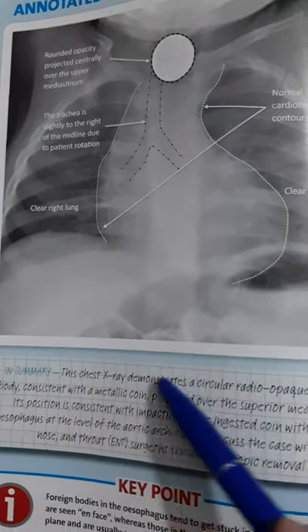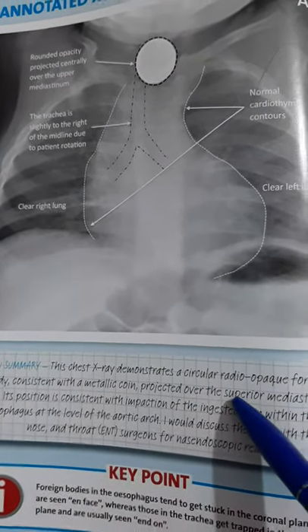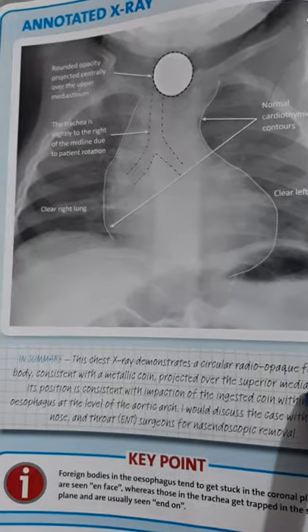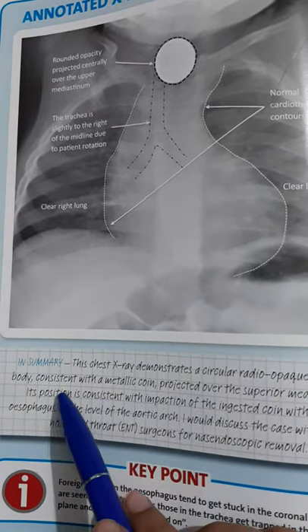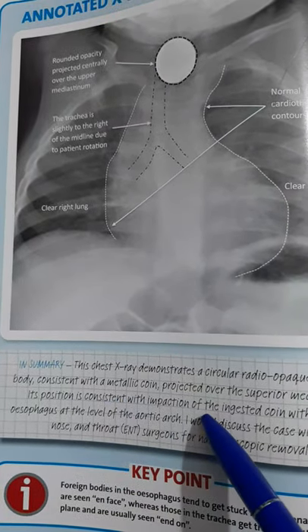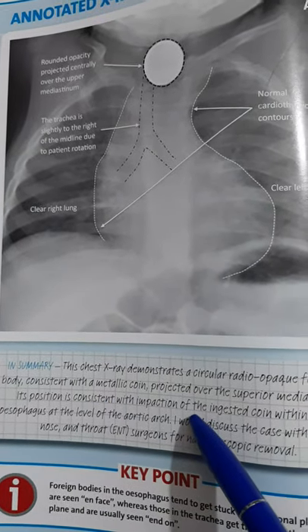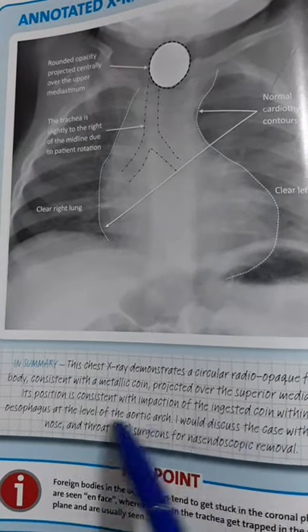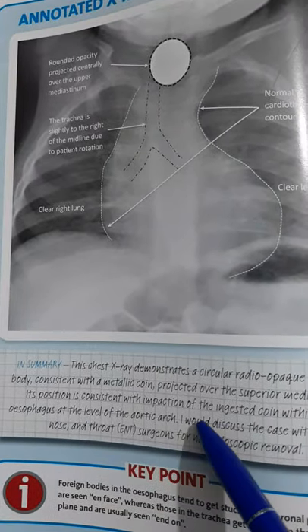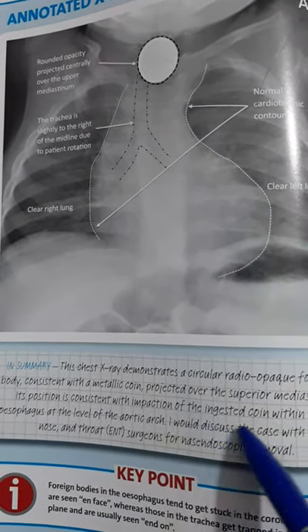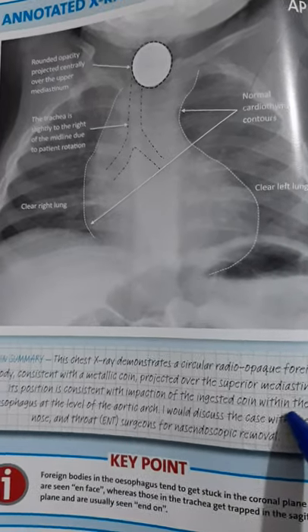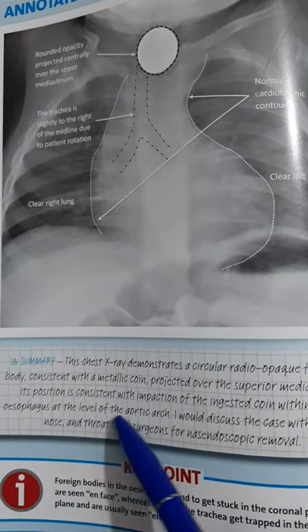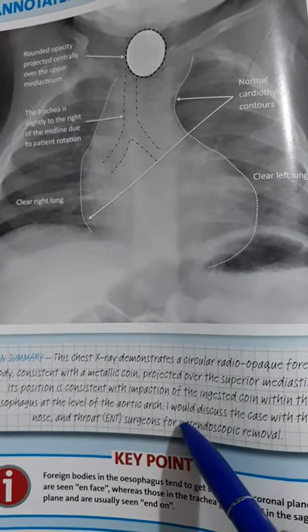In summary, this x-ray demonstrates a circular radio-opaque foreign body consistent with a metallic coin projected over the superior mediastinum. Its position is consistent with impaction of the ingested coin within the esophagus at the level of the aortic arch.